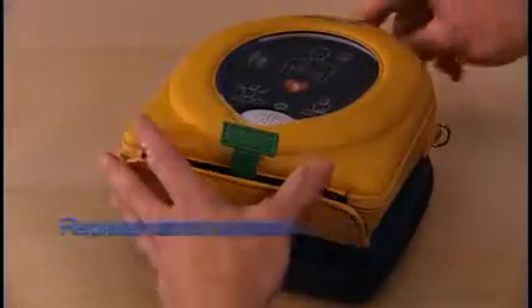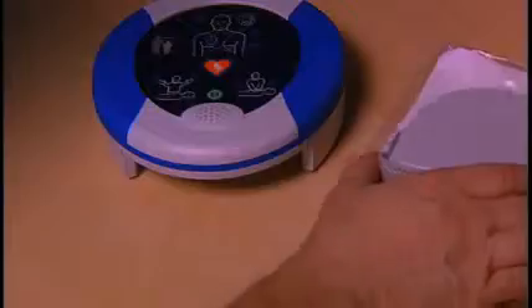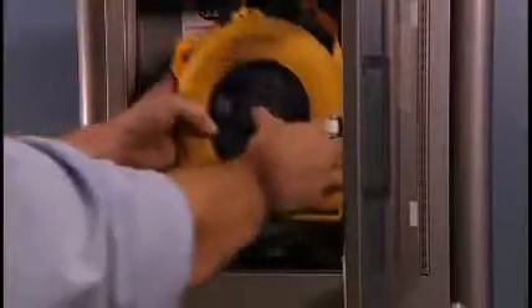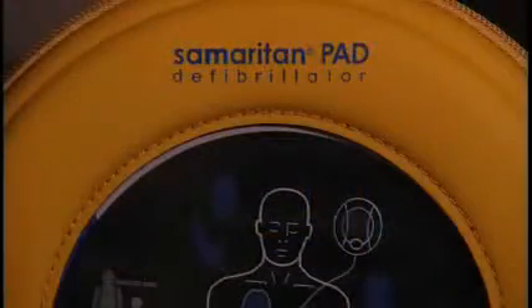Check the expiration date of the pad pack and replace it prior to the listed expiration date. Remove the pad pack by squeezing the tabs and sliding out the cartridge. Next, slide a new pad pack into the unit and store it as usual. Periodically check that the green light is flashing so you know the unit is ready in case of an emergency. Follow your local battery disposal guidelines for disposal of the pad pack.